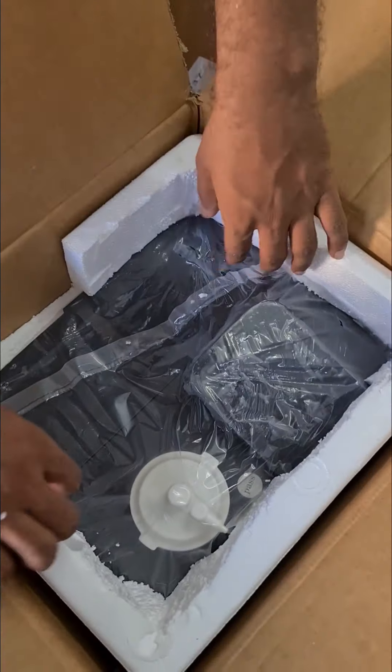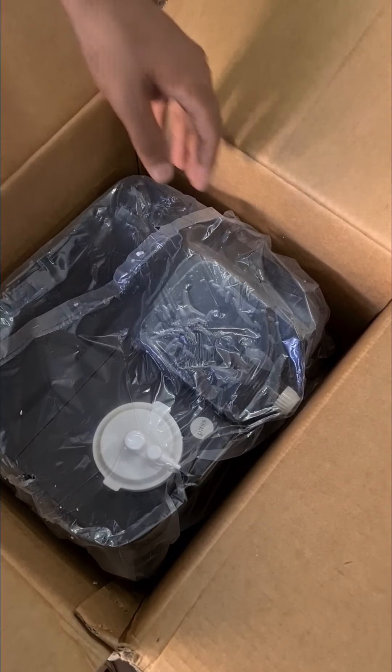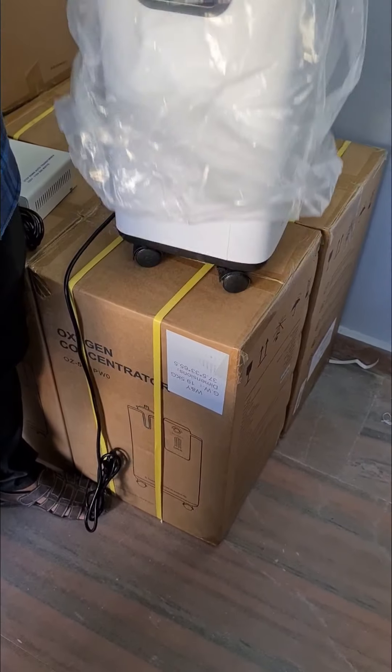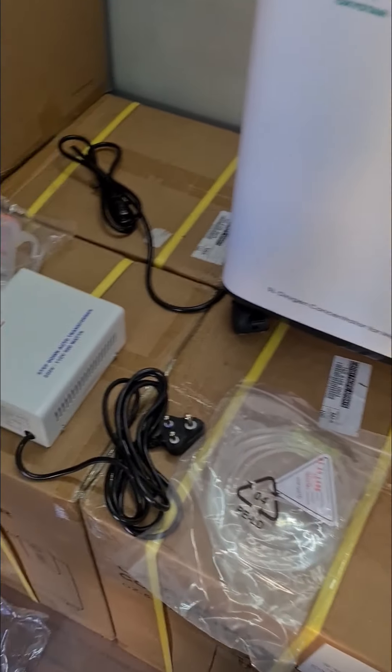Keep that aside. Now he is taking the main unit. Lift it carefully — see how he is holding it on both sides. Take it carefully and keep it aside. So these are the full contents that you will be getting in the carton box.